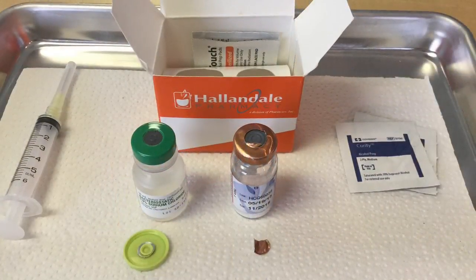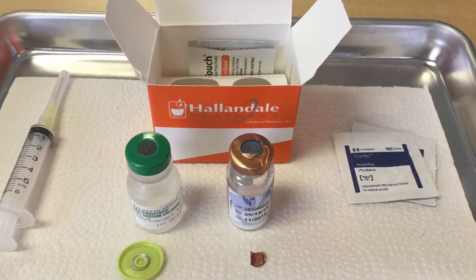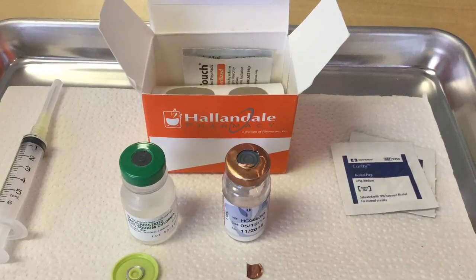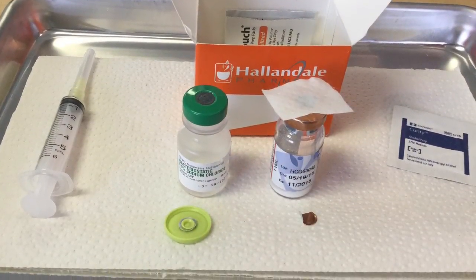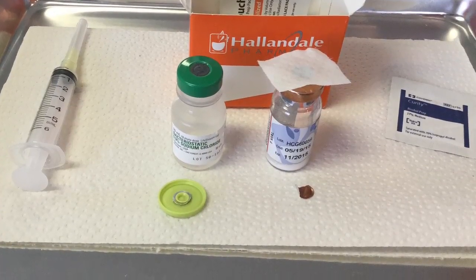So in the next picture, we see the cap of the bacteriostatic sodium chloride has been taken off, as well as the cap of the HCG vial. You pop those off, and then be sure to wipe the top with a clean alcohol pad every time you're going to use a needle in a bottle.